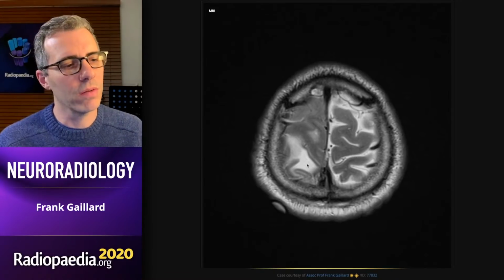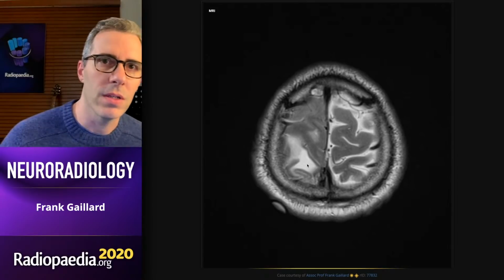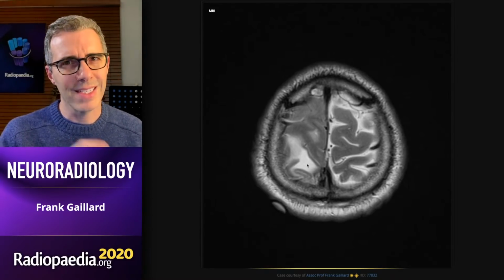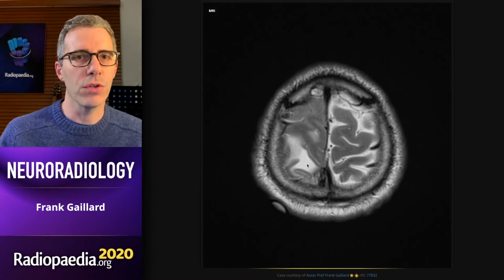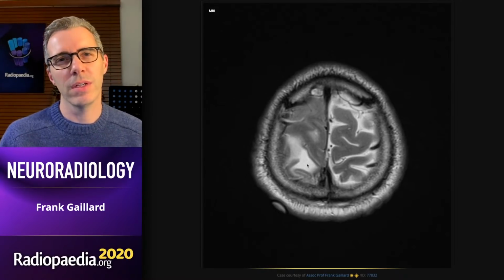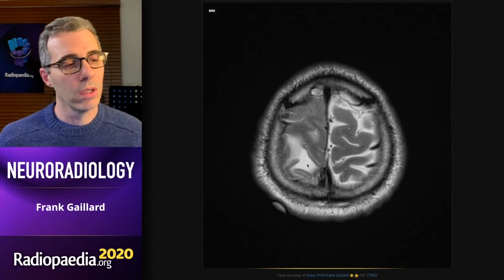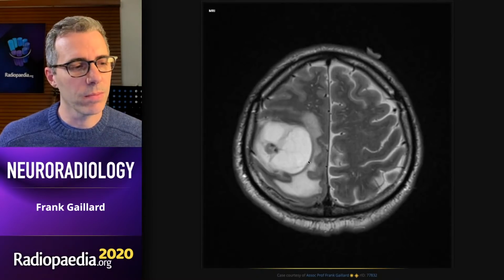We see this phenomenon very prominently in a tumor that no longer exists according to the WHO, which is protoplasmic astrocytomas. And when you see that feature within the tumor, areas of tumor that are not cystic, but are very bright on T2 and then suppress on FLAIR, it's a very good indication that you're looking at an astrocytoma and not an oligodendroglioma. And here it's just telling you that there is abundant vasogenic edema.